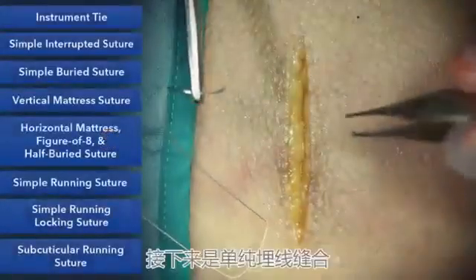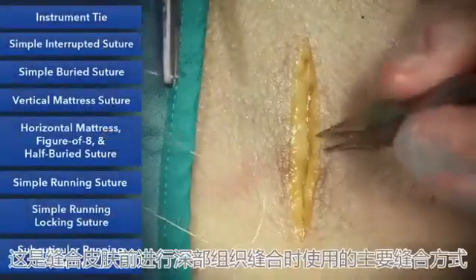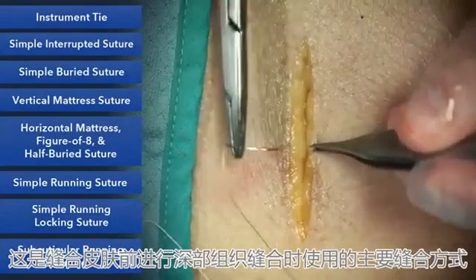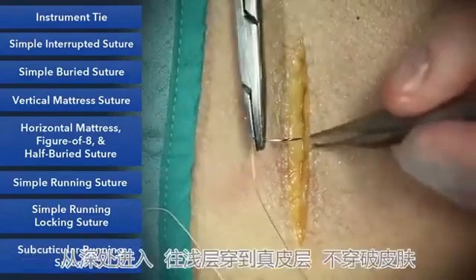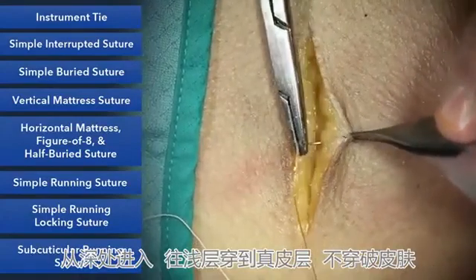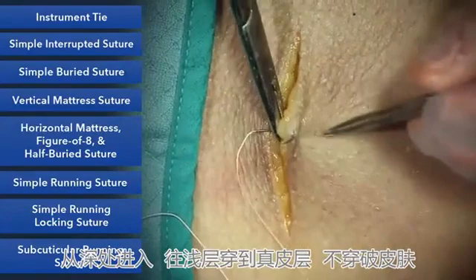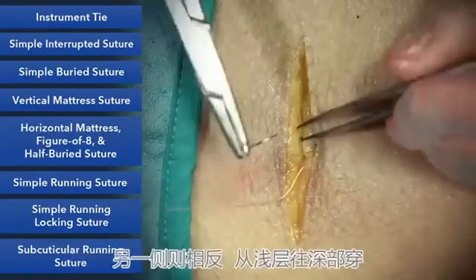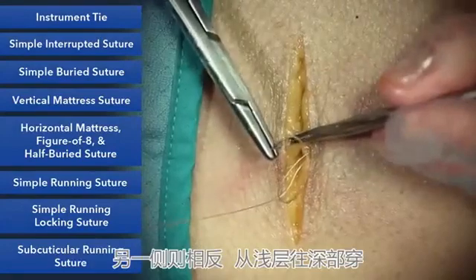Next is a simple buried suture. This will be the main suture you'll use when putting some deeper sutures in before putting your skin suture in. It's important to bury a suture that we start deep and go superficial and end up in the dermis without buttonholing the skin. And then on the opposite side, we're going to do the opposite. We're going to go superficial and then deep.